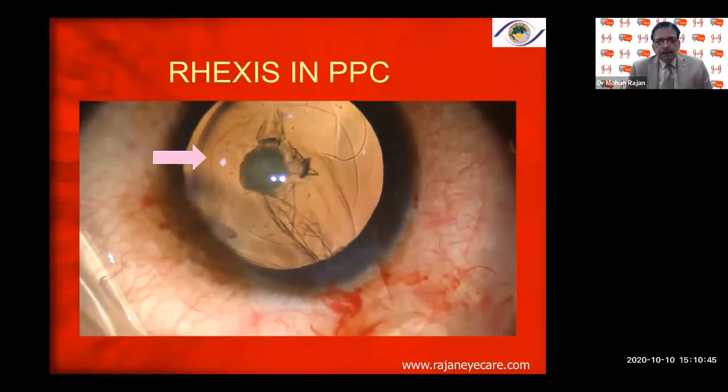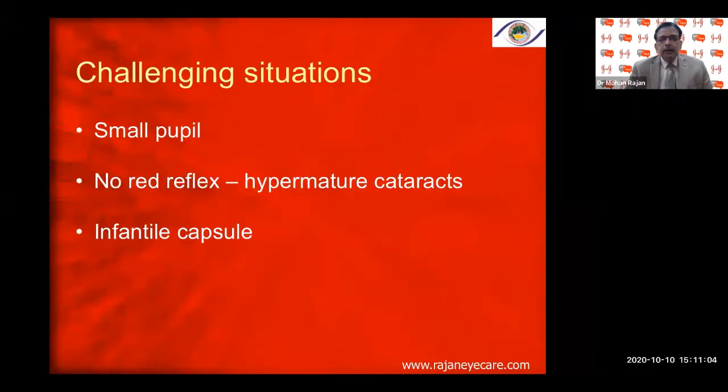Always catch the base of the capsular rhexis margin and not the tip — that is very important. During the entire procedure, keep the anterior chamber very deep, and always make sure you don't depress the posterior lip of the incision. If you do, the viscoelastic escapes, the anterior chamber becomes shallow, and the rhexis can go to the periphery.